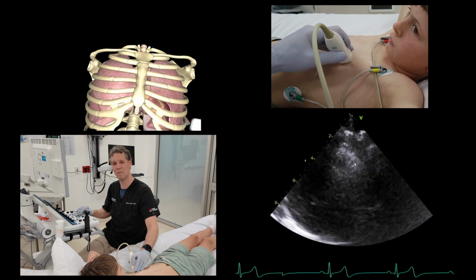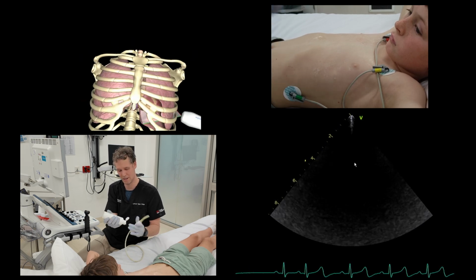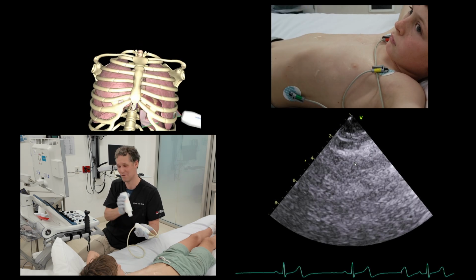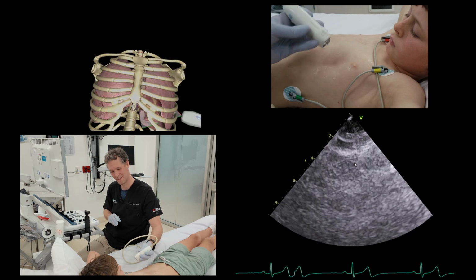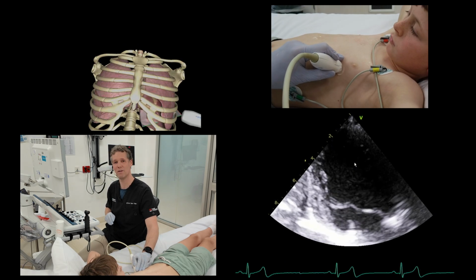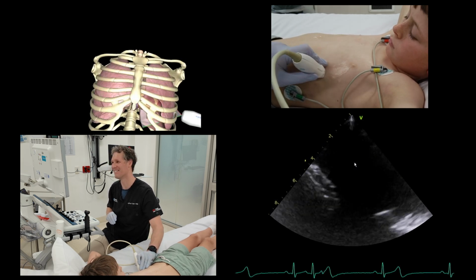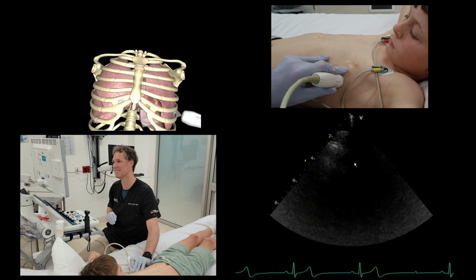Lung ultrasound is generally fine. When you're looking for the lung, you find the heart. When you're looking for the heart, you find the lung. That's just fairly common for all of us, unfortunately. See, there's a perfect two-chamber view that I couldn't find before. It's ideal. And just try and find a little spot where there's just lung.